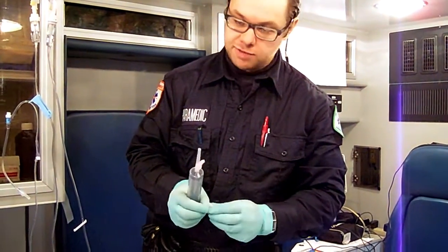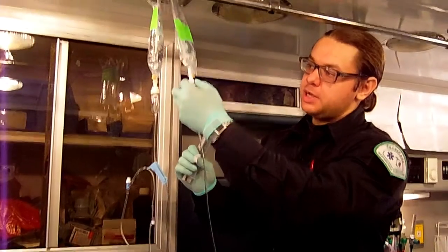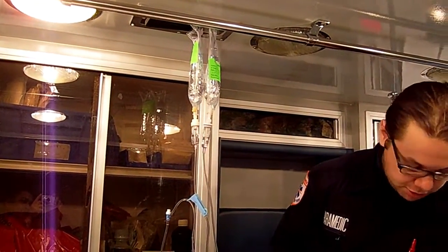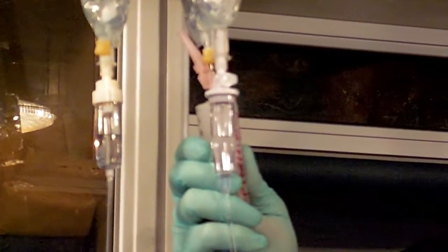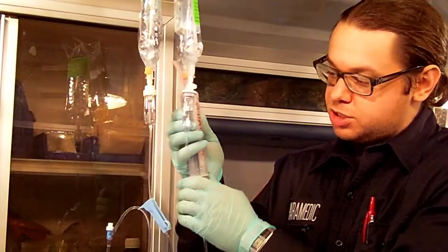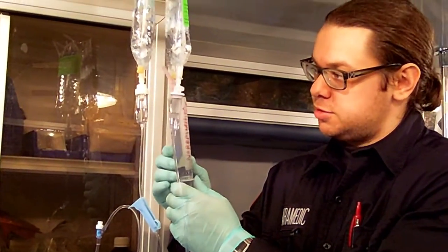Take an alcohol swab or chlorhexidine and wipe the medication port — this is the port you're going to take your medication from. Let it dry, then take your syringe and withdraw 60 cc of the medication. The beauty of this is that while I'm withdrawing the fluid, the patient is not off the pump — they're still getting the medication they need, their blood pressure is not dropping, and everyone is safe.